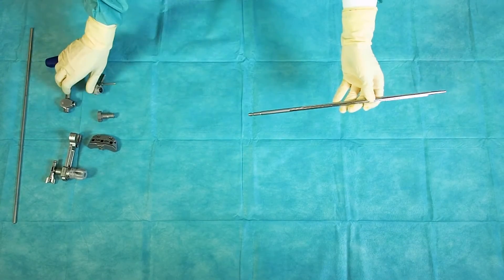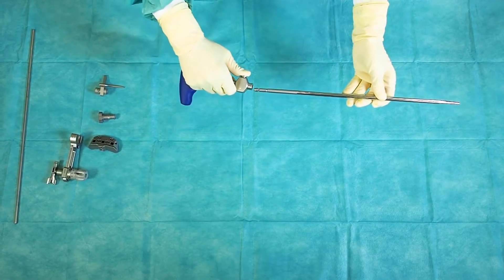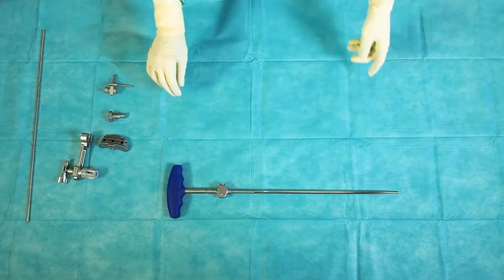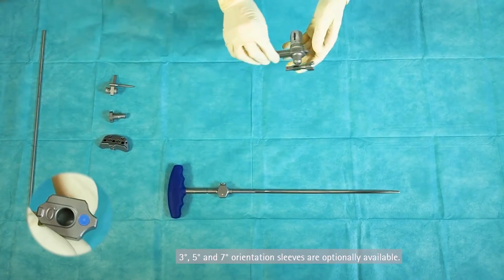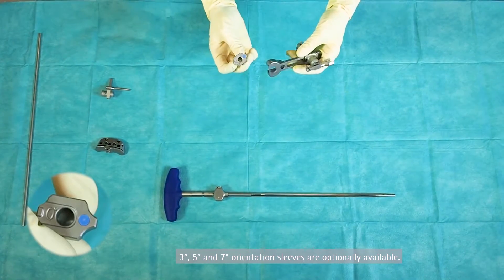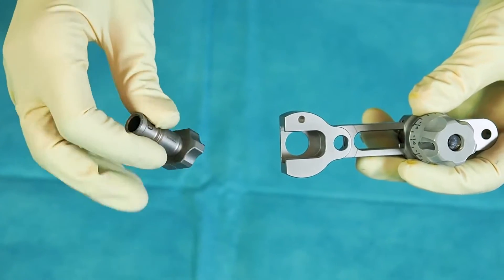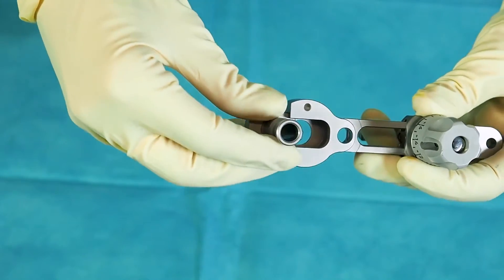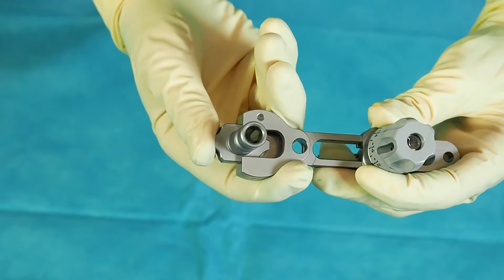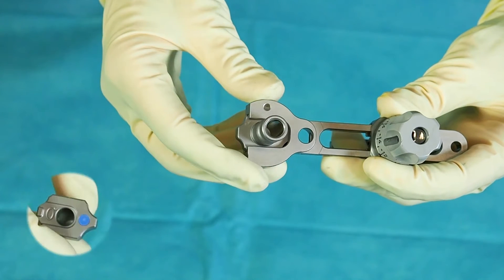Push the button of the T-handle to couple it with the intramedullary alignment rod. Connect the tibia orientation sleeve to the intramedullary alignment system. The 0 degree orientation sleeve indicates a 90 degree tibia resection in relation to the intramedullary canal. A 3 degree posterior slope is integrated in the gliding surfaces.